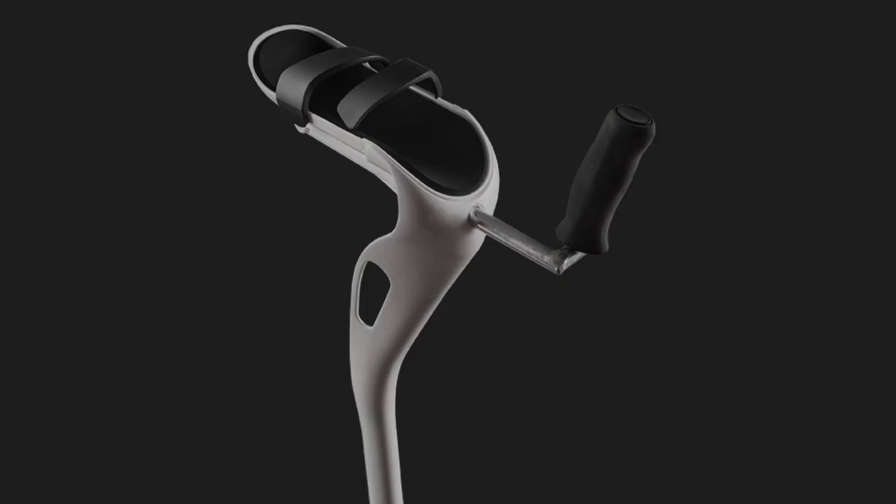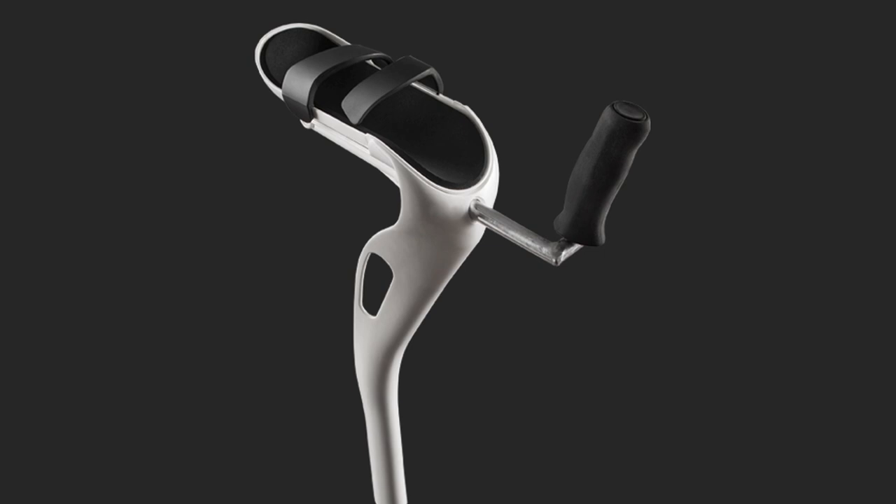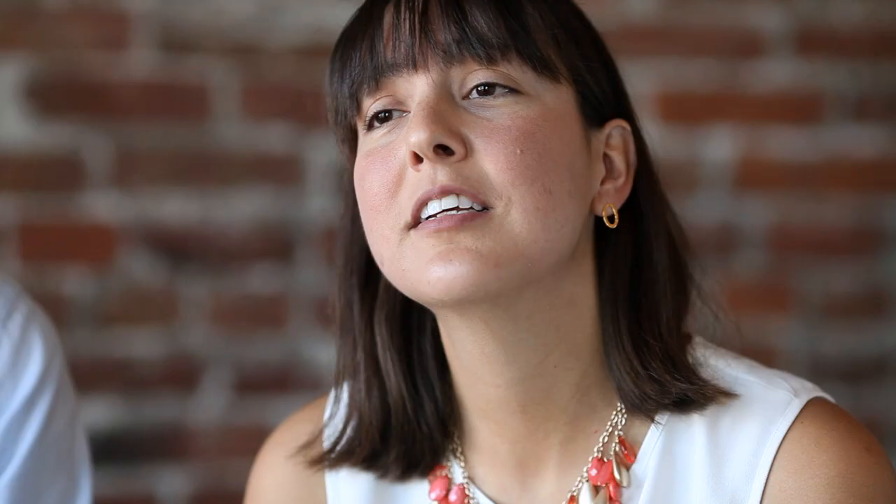If you've ever been on crutches or know somebody who uses them, you know how painful they can be. Please support our campaign and help us make this a reality for all those people whose lives can be greatly improved by our product.